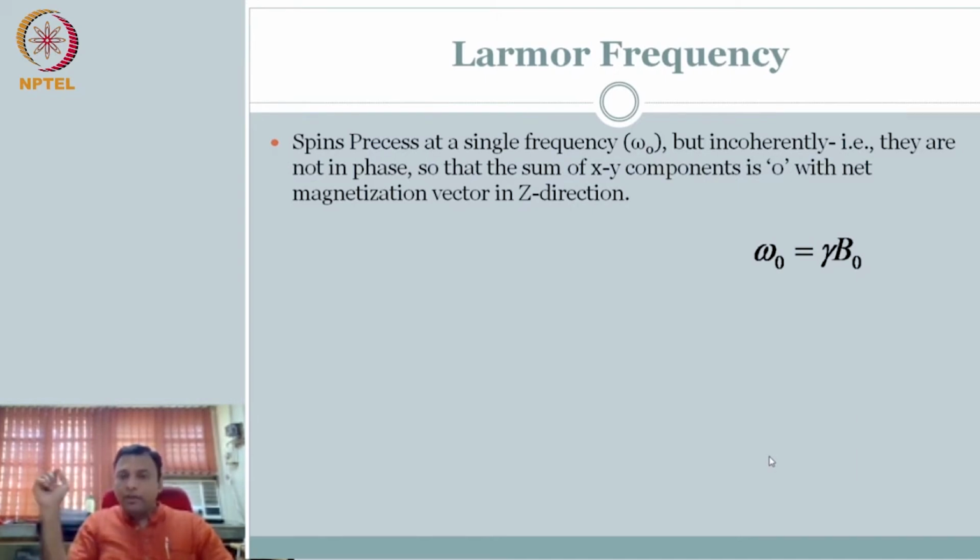So what is going to happen? Each of you, whichever starting position you had, will make an attempt to come here. But when you come here, you are not going to align. You are going to precess around. Of course, some of you will go down, but the nature of things is, most of you will obey the command. That means nature says that most people will go to the up state rather than the down state. So there is going to be a net positive, right?